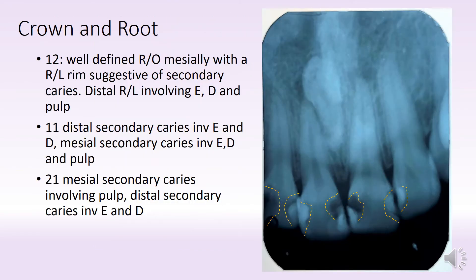So let's look at the crown and the root of this particular area. Very clearly we can see that there are a lot of radiolucencies which are mixed with radio-opaque areas. So let's start with the one on the most left, which is the 1-2.